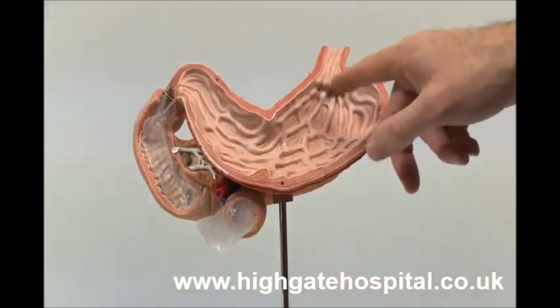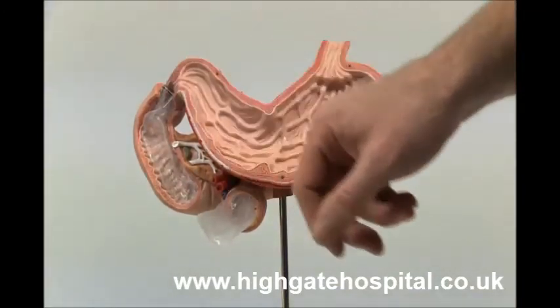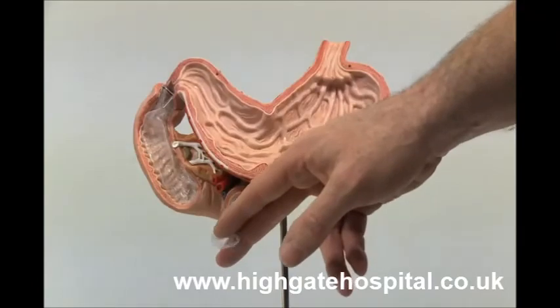We use an endoscope to pass the delivery device through the stomach, and then we use that to essentially unfurl this plastic tube into the small bowel.